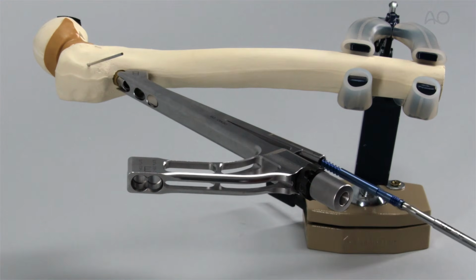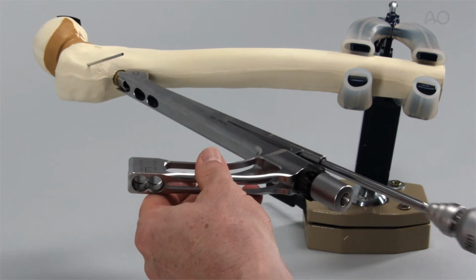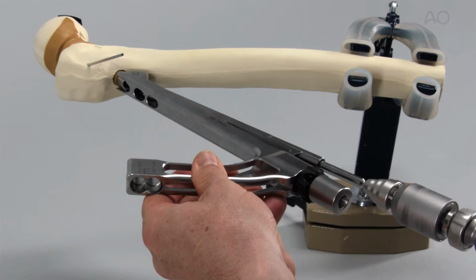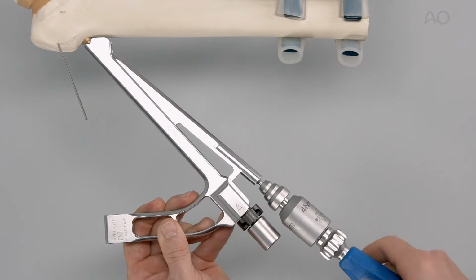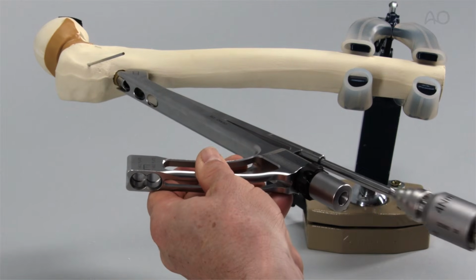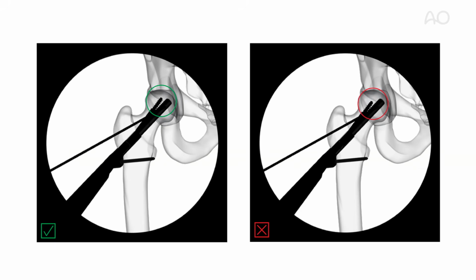The 85 mm anti-rotation screw is manually inserted with the 4 Nm torque limiter. An audible click is heard when the screw reaches the 4 Nm limit. Clinically, image intensification is taken to verify that the anti-rotation screw is fully inserted.